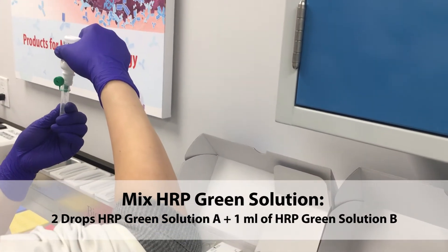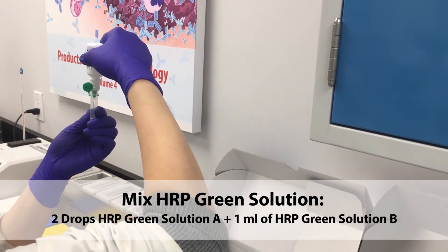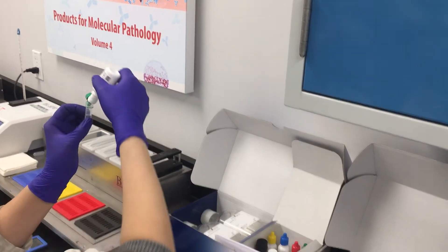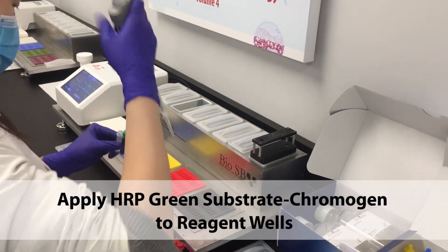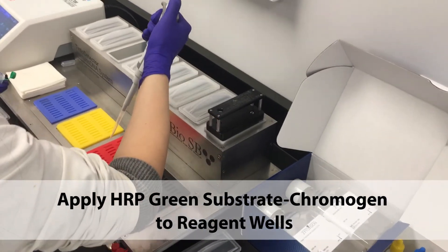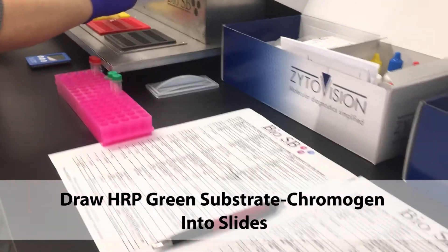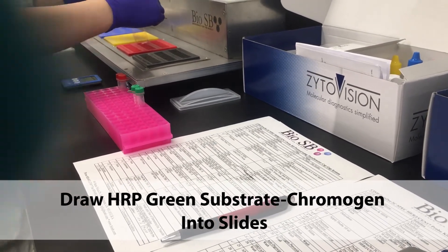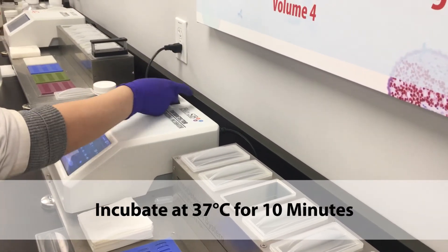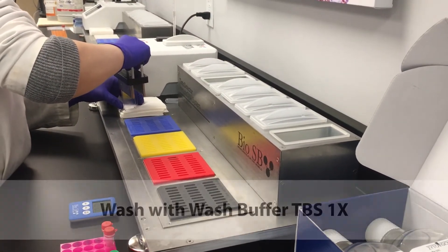With the slides resting, mix the HRP Green solution and apply the HRP Green substrate chromogen to the reagent wells. Draw the HRP substrate chromogen into the slides and incubate at 37 degrees for 10 minutes. Wash with wash buffer.